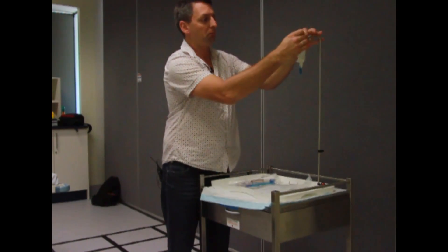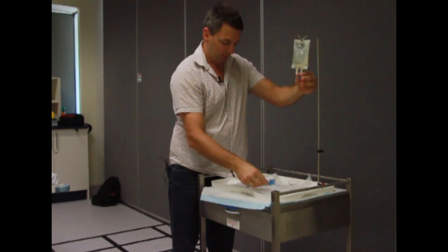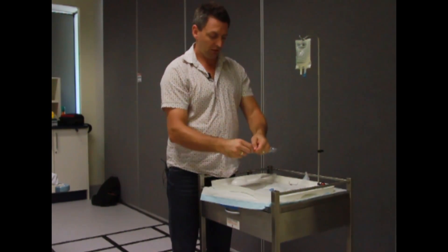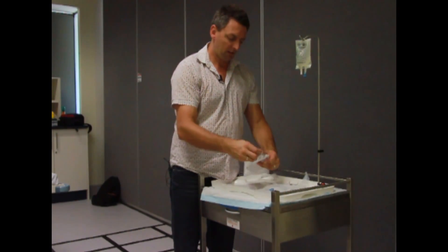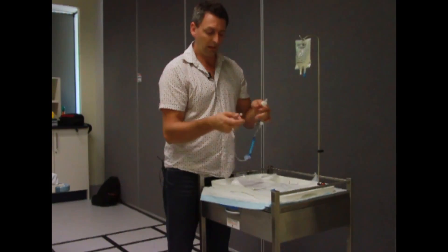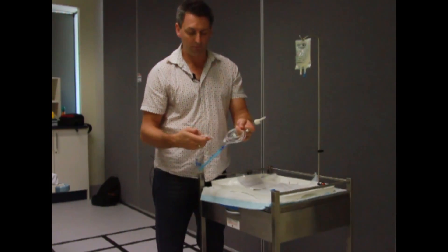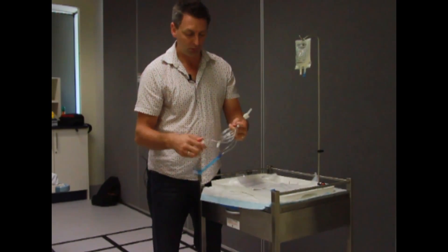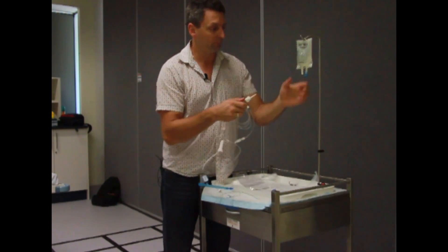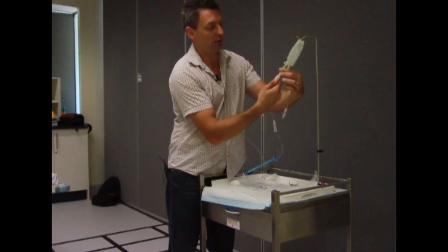We're hanging our bag up just the same as the giving set before, and twist off the blue cap at the bottom. Get our new giving set, take it out of the packet — remember, keep it off the floor. This one has tape, so just take that stuff off as it just makes it too hard. Put your roller clamp on, then take your dust cap off. Hold your bag still and gently push and twist.